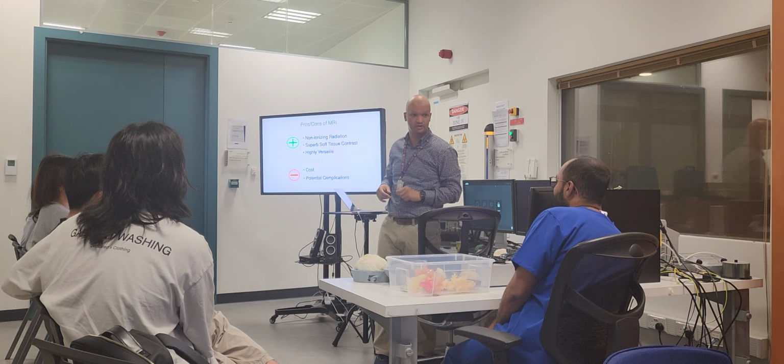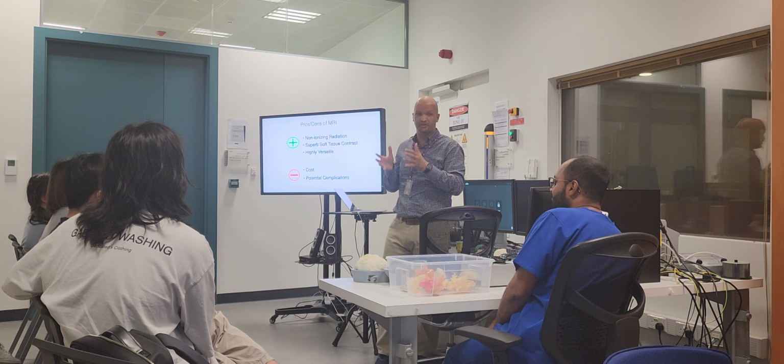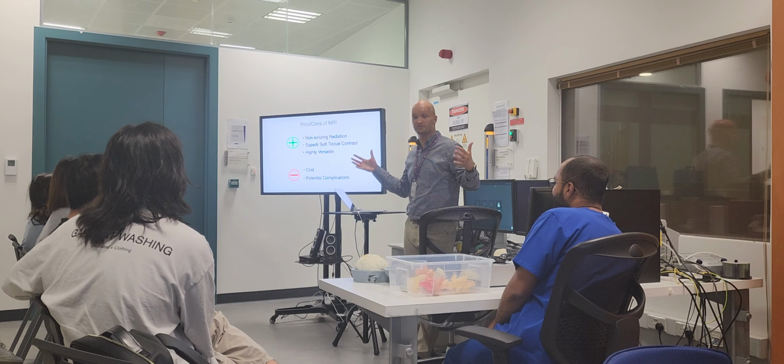I have to have them change like you. So it's complicated. Okay, we can, but we have to screen every single one of them just to make sure that you are safe when you are inside. Yeah, and prizes and all that. So it requires training. And that was one of the challenges, to come to campus and have a big magnet like this. Our cleaners are trained.